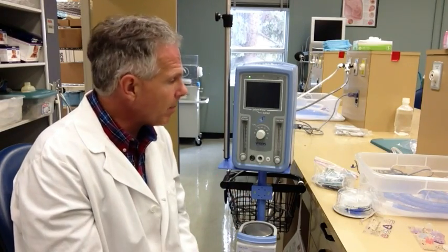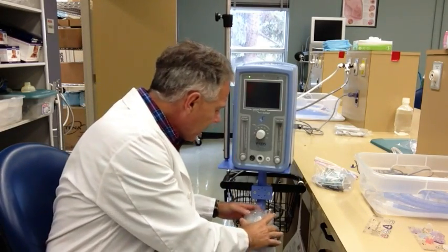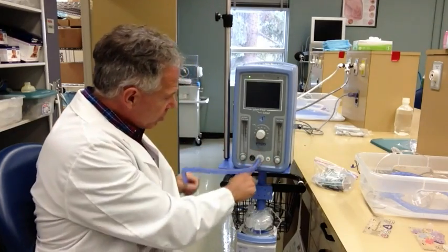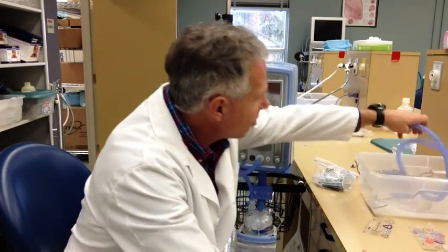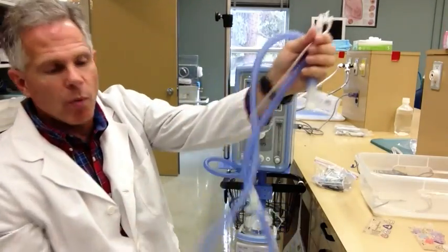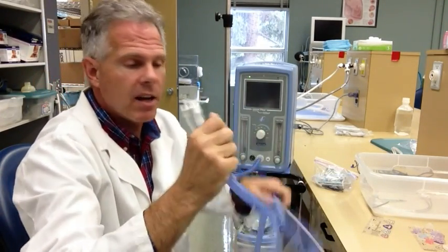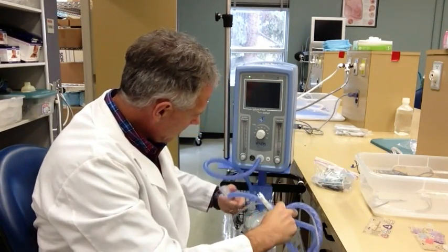So let me show you how that's set up. Before we get going, I like to put the circuit on first. It's a heated circuit - we've got our Fisher-Paykel heated inspiratory line here. We need to get our gas from the ventilator, so it hooks up right here to the humidifier, and then from the humidifier to the patient. It does come with special fittings on the end to hook up directly to the specialized patient connector.